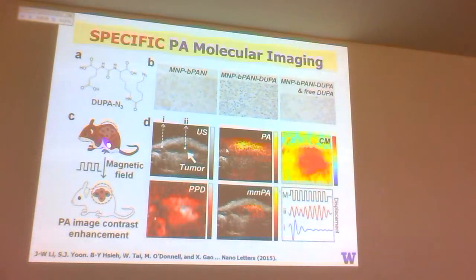and we have, again, this mouse model for a tumor. We are able to target the specific cell line here with these magnetic particles. We make the ultrasound image. You can hardly see. The photoacoustic image is this huge blob of stuff because of near-field reverberation. This is something Martin Frenz has talked a lot about, which is real when you try to do clinical work, this near-field cloud that you have with photoacoustics.